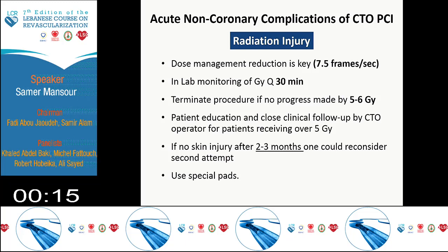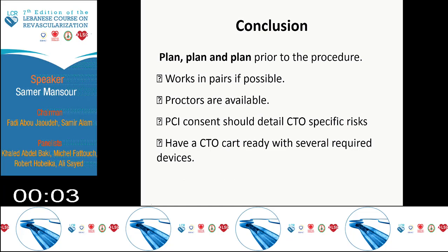Usually, if we go up to 5-6 grays, we can consider reattempting 2 to 3 months after the procedure if there are no signs of radiation dermatitis. And there are more and more special pads that you can use that will prevent radiation exposure for the operators also.